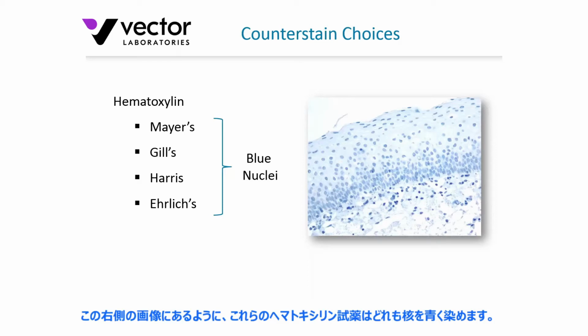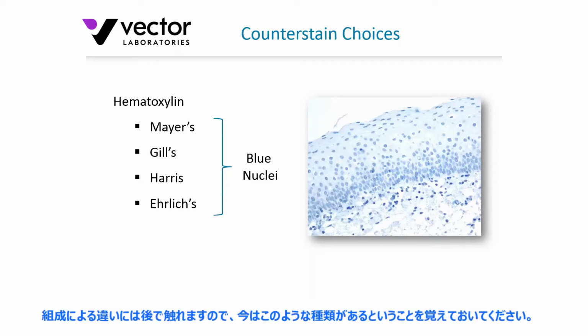So any or all of these would certainly be suitable for generating this sort of image on the right-hand side that I've got here. This is not an exhaustive list. There'd be some considerations, though, as we'll mention later on, about certain formulations of hematoxylin. So just keep that in mind.